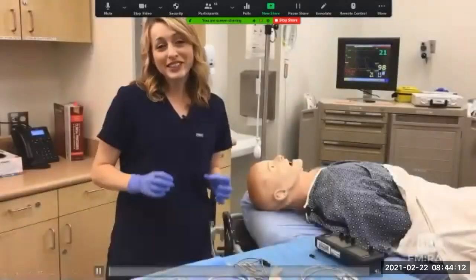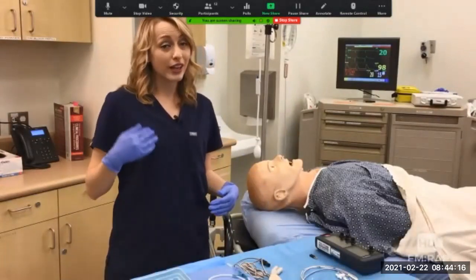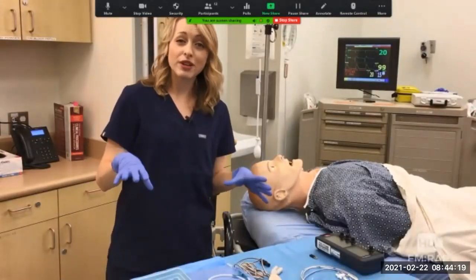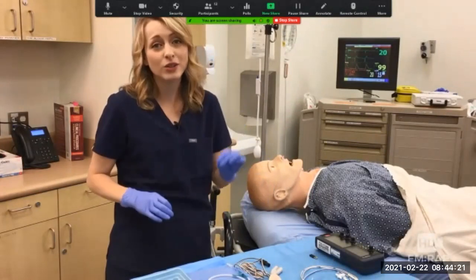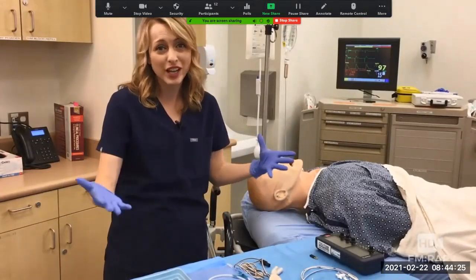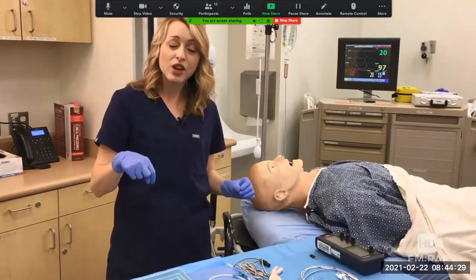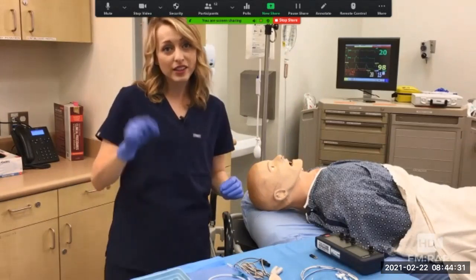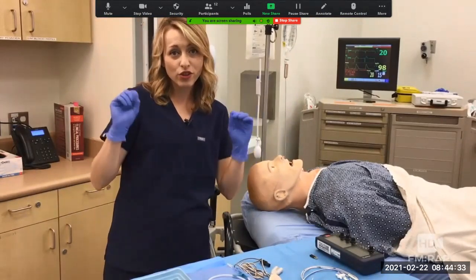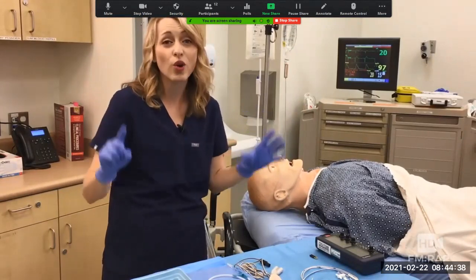All right. Placing a transvenous pacer is pretty much exactly like putting in a big central line in the right IJ, with the only difference being that we're putting in a single lumen, big old Cordis line in the right IJ instead of, say, a triple lumen that you may more typically use. And then through that single lumen, we're going to put in a pacing wire that's going to go all the way down to the right ventricle where it's going to pace the heart. So you got this. You can totally do this.